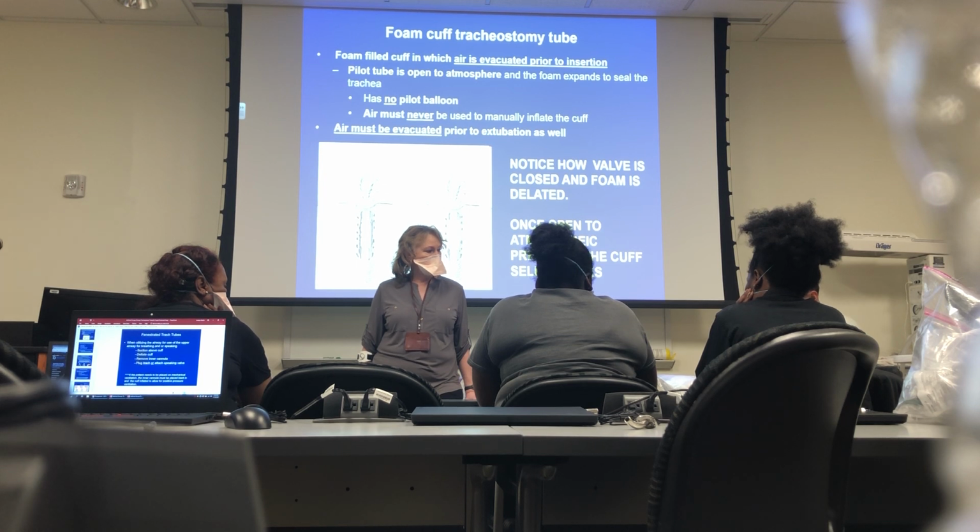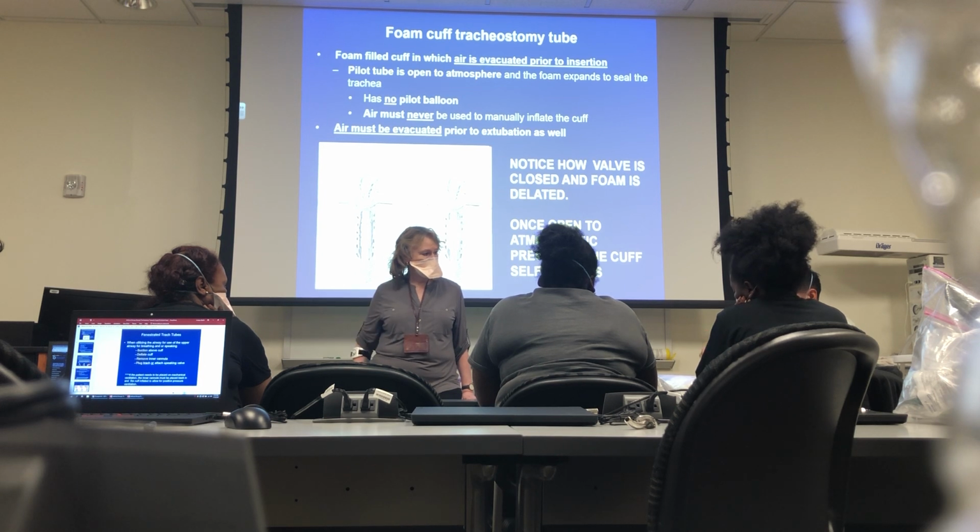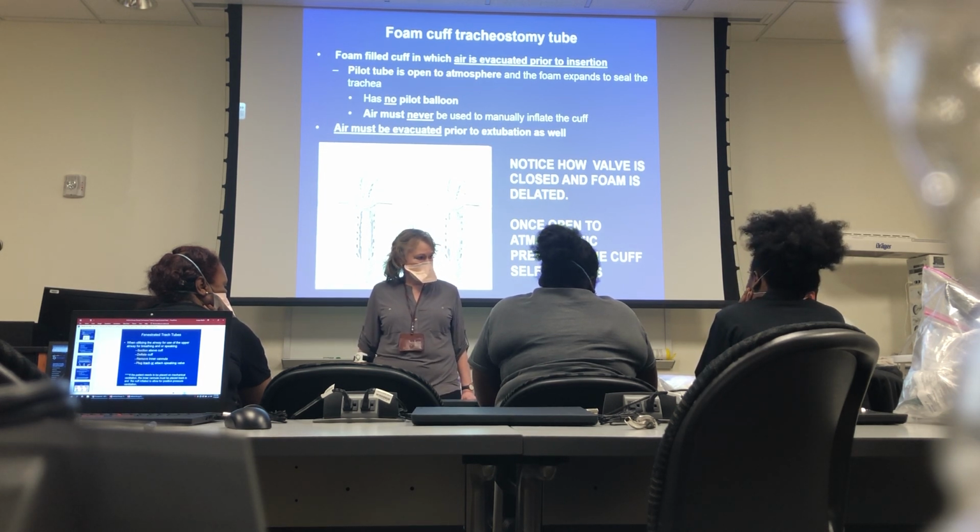Okay, so Henry, are you squeezing that? You don't want to squeeze it. Go ahead, pull the air out. Now before you disconnect the syringe, you have to squeeze that, because if you don't squeeze it, what's going to happen? It's going to inflate again. All right, now pull more air out because you have to totally deflate it. So you see what you're doing there? Unsqueeze.